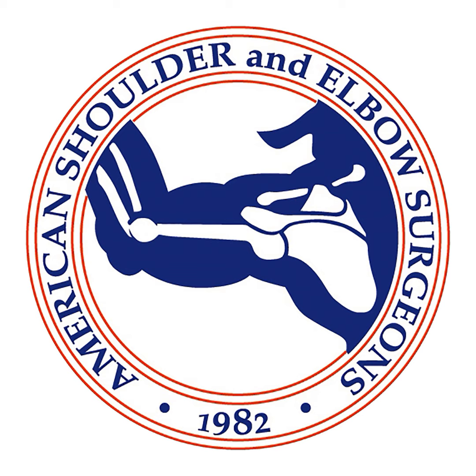We've also recognized, at least I've seen in my practice, frankly, that humeral component malposition is not that uncommon at the time of revision, particularly with freehand cuts. So when you have malpositioned components with stems going a significant length down the arm, it can make removal difficult, particularly in the setting of being cemented. The last thing I would say about that, as Mike said very nicely, is stress shielding. We now know that certain geometries of stems and perhaps some coatings have been associated with a higher rate of stress shielding and bone resorption, and that also can be concerning. I would add another disadvantage to the stemmed implant: the risk of an intraoperative fracture.